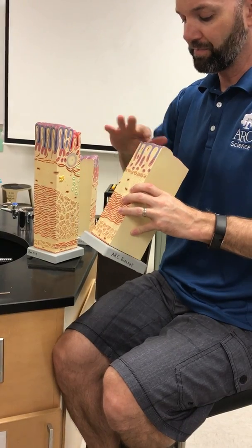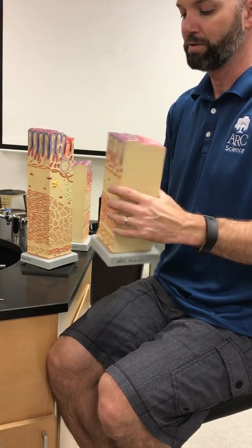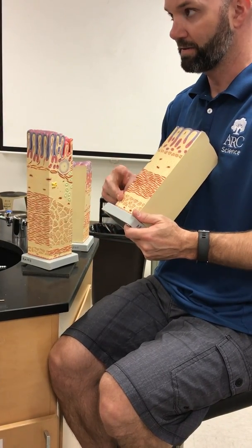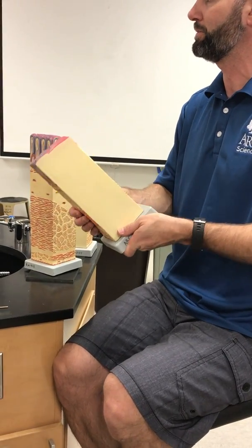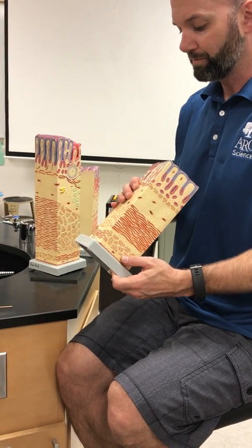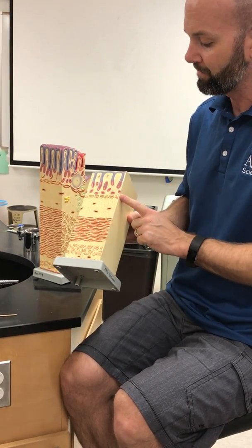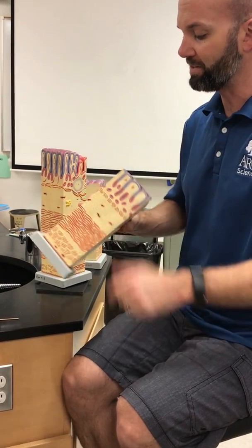And then here, it's flat. We've got mucosal glands, no submucosal glands. So this is the stomach. What do you expect to see when you're in the stomach? A third layer not shown here, but we're not quite there yet, right? We're right at the junction. So a little bit further in and we'll start to see that third layer. But we already see gastric pits, the holes, leading into gastric glands. So the pits are the blue and the glands are the red, but they're not showing us the different cell types.